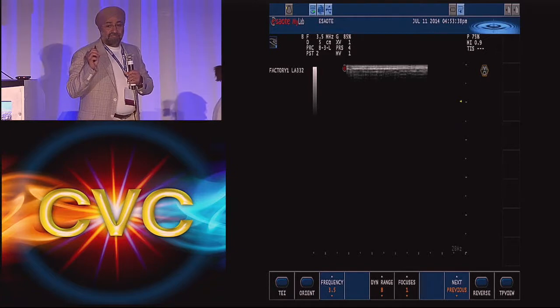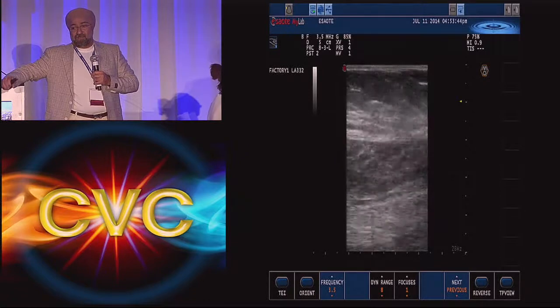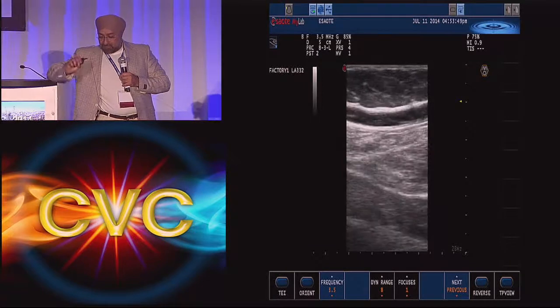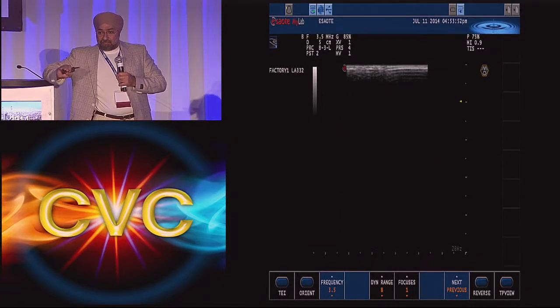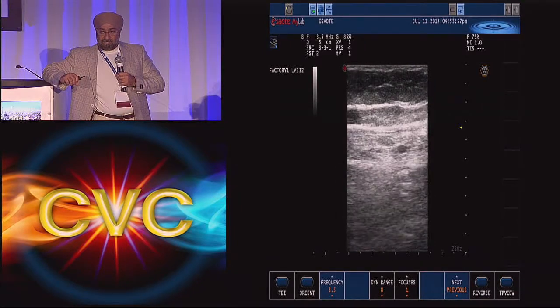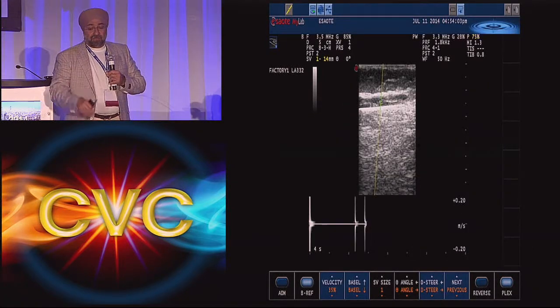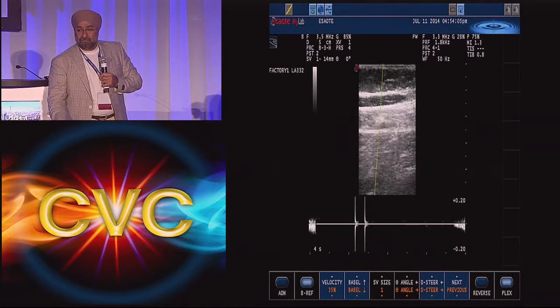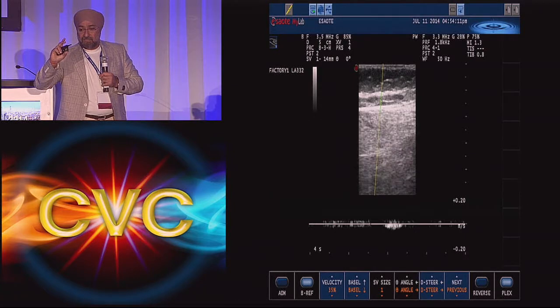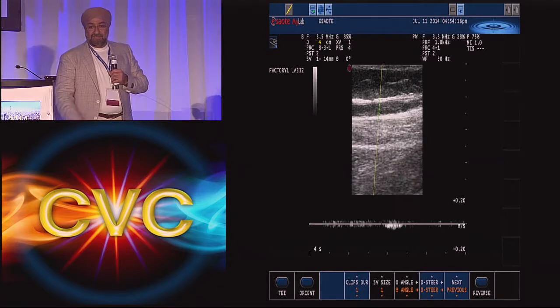So there are very few cases where just straightforward saphenous vein ablations will solve all your problems. So you say it's a perforator, right? We use the vascular sheath. That's okay. Then you just take care of it at the point of the perforator. I don't know if you saw the video. The principle there is you don't want to ablate the deep system. If you had a pipe that's leaking through the floor, that's your fascia, and it's 6 inch, and then it goes out, you want to catch it just as it comes out through the floor and seal that.